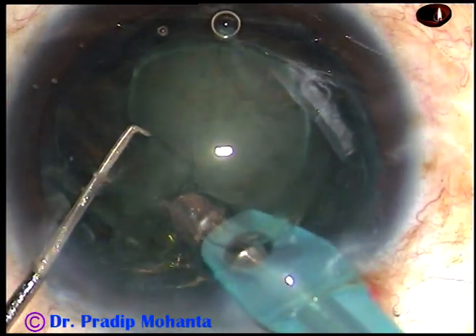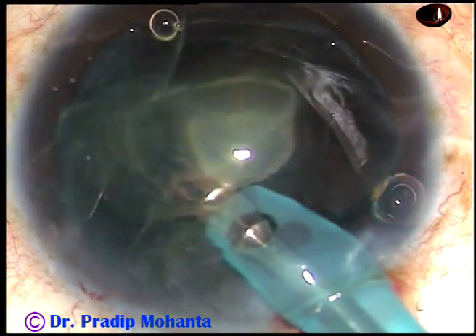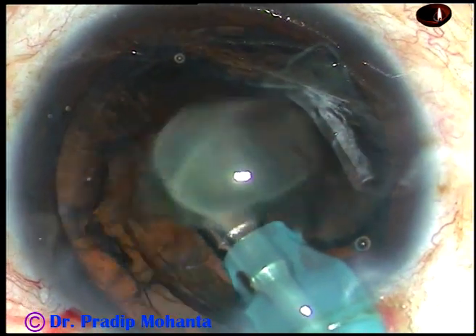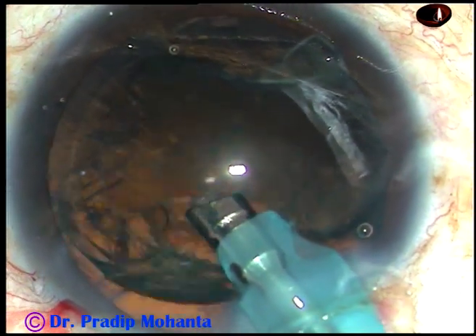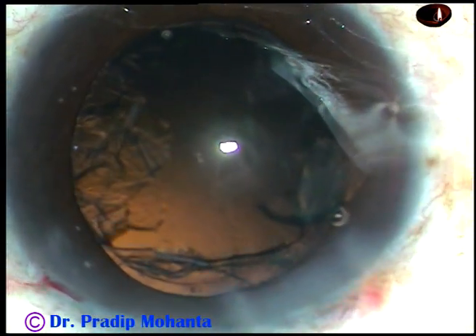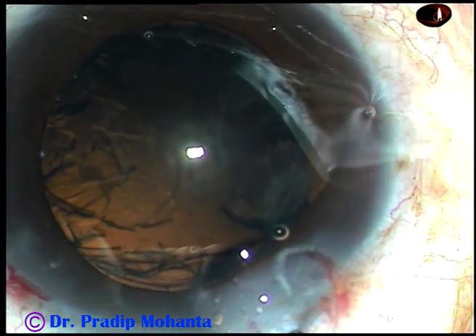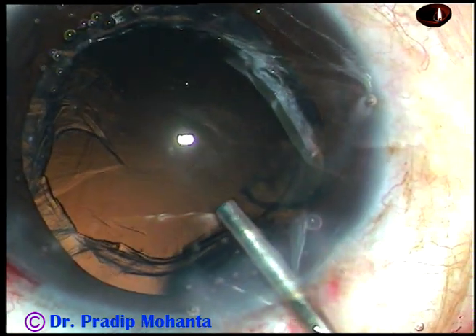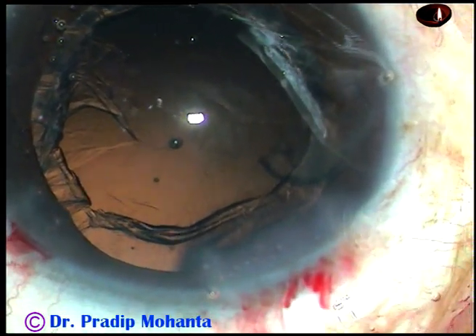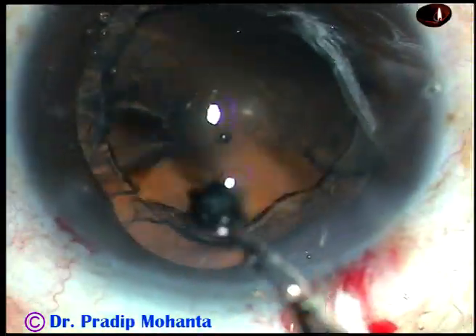The mass rotates and disappears within 30 seconds. It's a very safe, very controlled, very slow technique. It got over in 30 seconds but it never appeared that it has been done in a hurry. So this is a very controlled way of managing these soft nuclei.